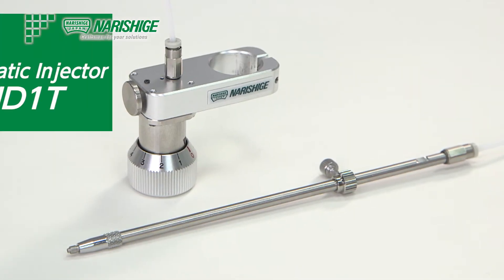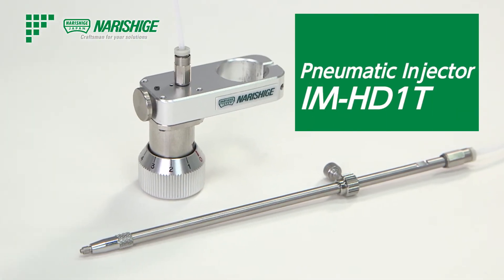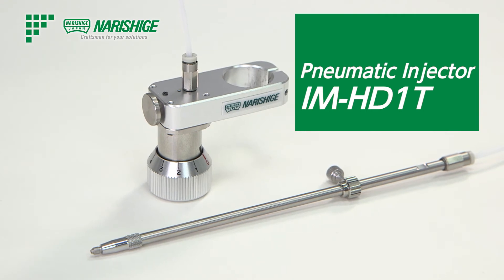This completes the introduction of the IM HD1T pneumatic injector for the holding side. If you have any questions, please feel free to contact us. Thank you.